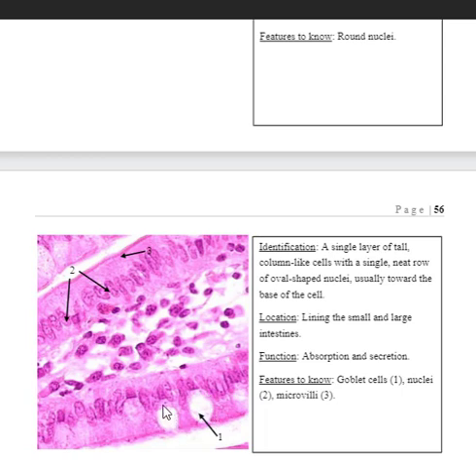But another thing that gives away that this happens to be from the intestines are these little areas right here. Here's one right there, there's one right there, and they open to the outside out here, or what we call the lumen, L-U-M-E-N, the lumen, or the opening or the middle part of your intestines. That would be where your food goes through and where your poop is forming inside, or your feces, if you want to be correct.